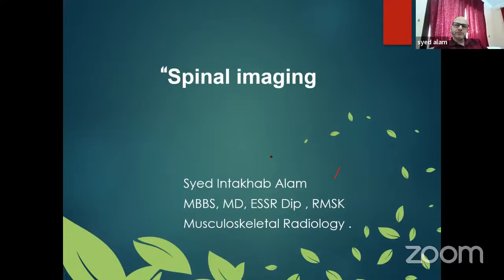I will talk about spinal imaging. Spinal imaging is a very interesting and very easy thing. Most of you know it already, so we'll just discuss it.